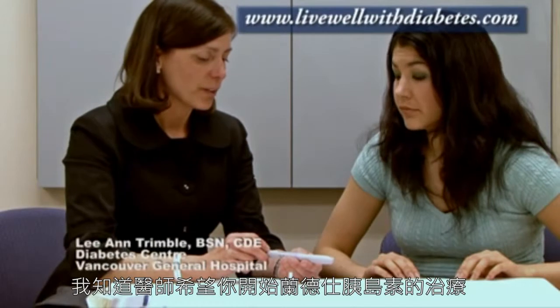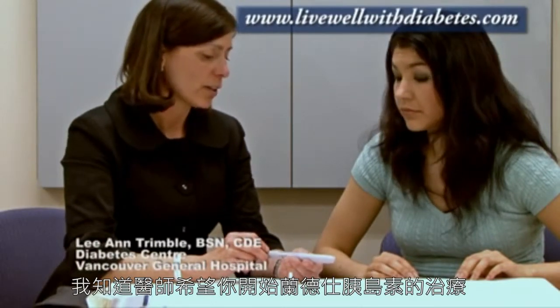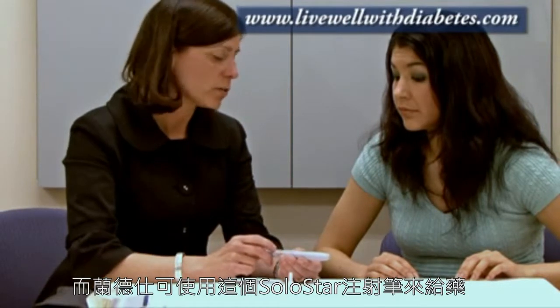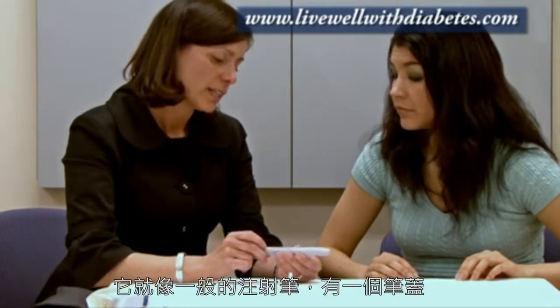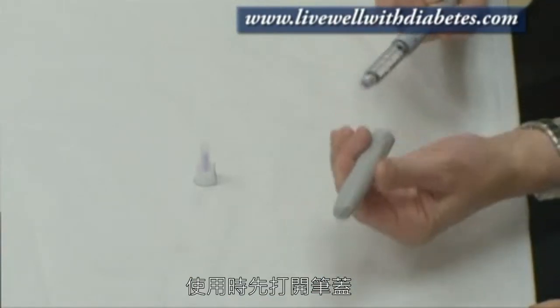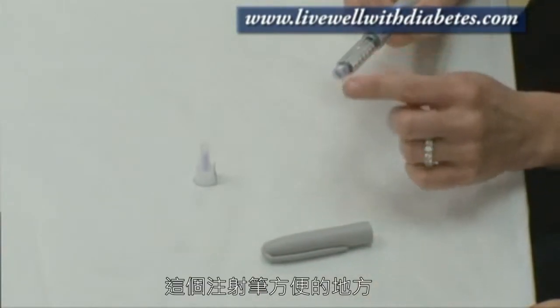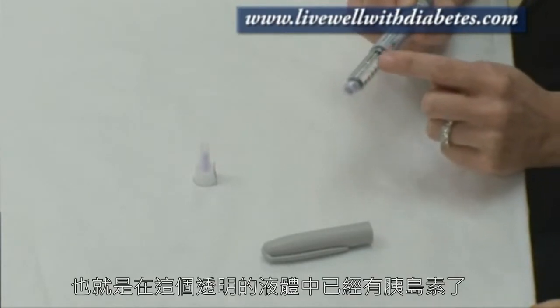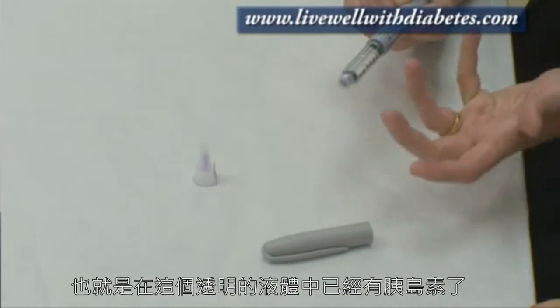Shama, I understand the doctor has asked you to start on the Lantus Insulin. Lantus Insulin can be used with what's called the Solostar pen. This is like a regular pen and it has a cap on it — just pull the cap off. What's interesting about this pen is that it comes pre-filled, so this clear liquid here already has the insulin in it.